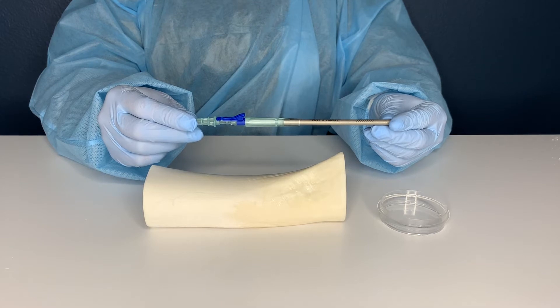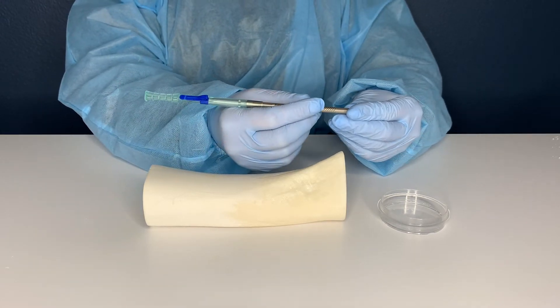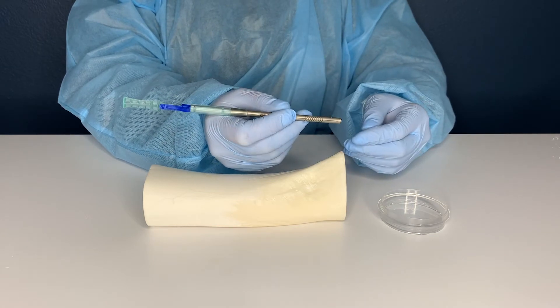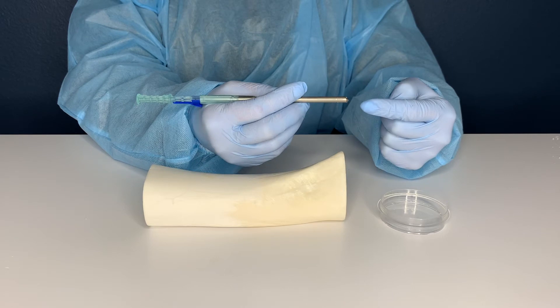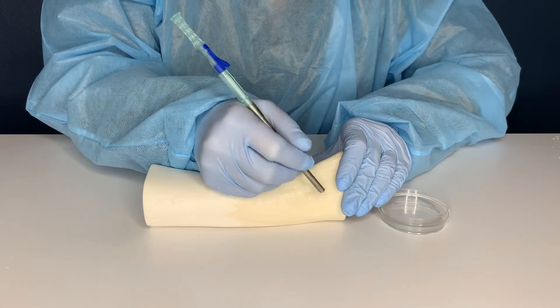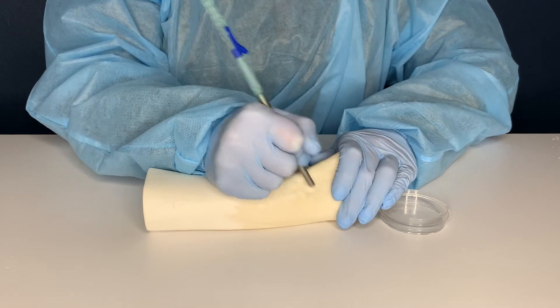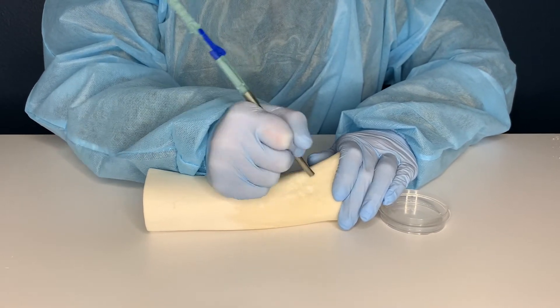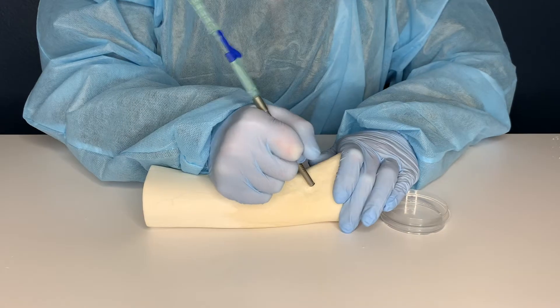To harvest bone using the Micross, hold the Micross with a pencil-like grip with the gray arrows oriented away from the patient's bone. The cutting blade is located opposite of the gray arrows. Place the cutting blade against the bone, apply pressure, and drag. The patient's bone and coagulated blood will collect in the chamber housed in the neck of the instrument.